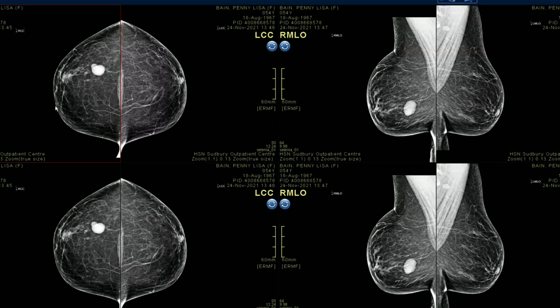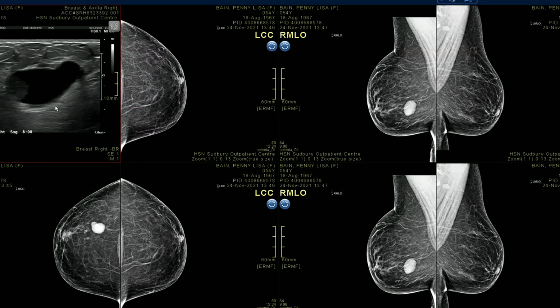with hemorrhage. So if fibroadenoma, when do you biopsy fibroadenomas? When they become palpable. So then we put fibroadenomas into 4A. Anything you want to biopsy has to go into 4A. Remember that, okay? So, sorry, into BI-RADS 4 category. So if you look at something, it's palpable and it is new, a patient comes, then you biopsy it, you know it's going to be a fibroadenoma, you put it into 4A. When you know it's going to be a cancer, put it into 4C or 5, okay?